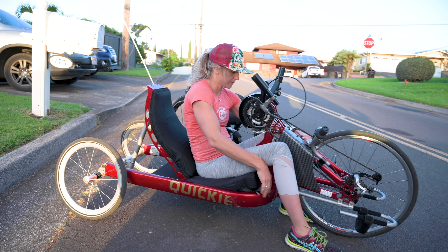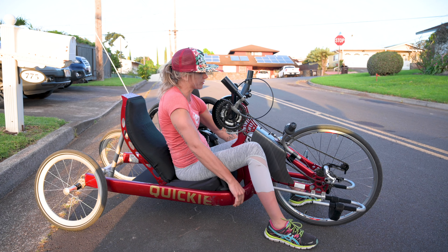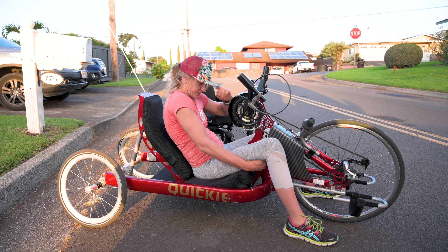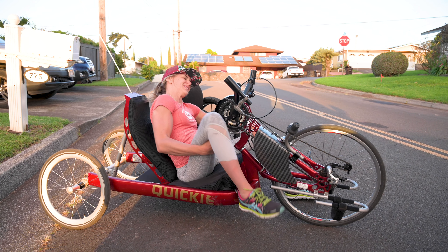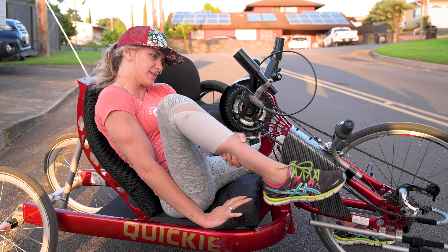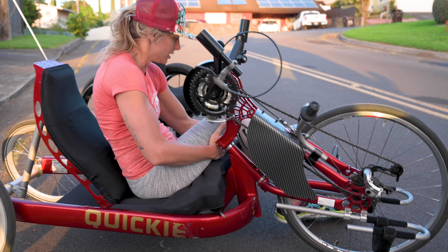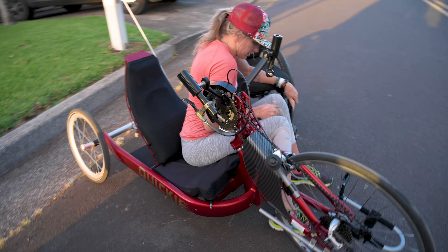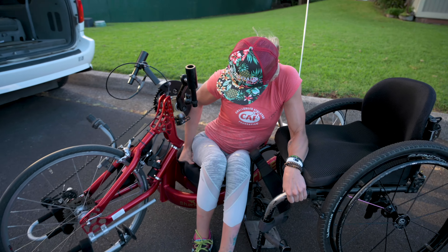Me and my weak ankles go everywhere. But getting back up out of the bike is the trick — we get laughed at all the time because we're really flexible. I don't know what somebody would do that has a whole bunch of tone, but I just pick it up and throw it over. I think Daryl does the same thing, and then both feet there.